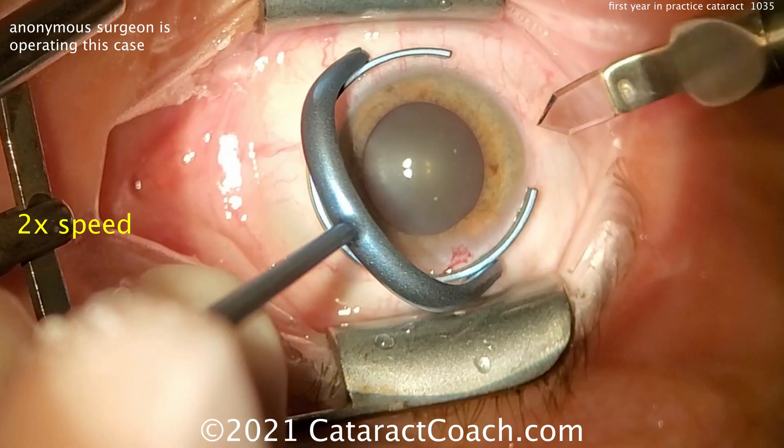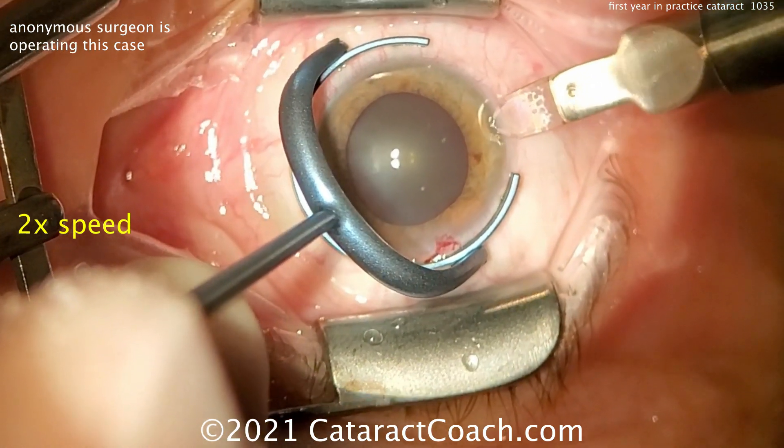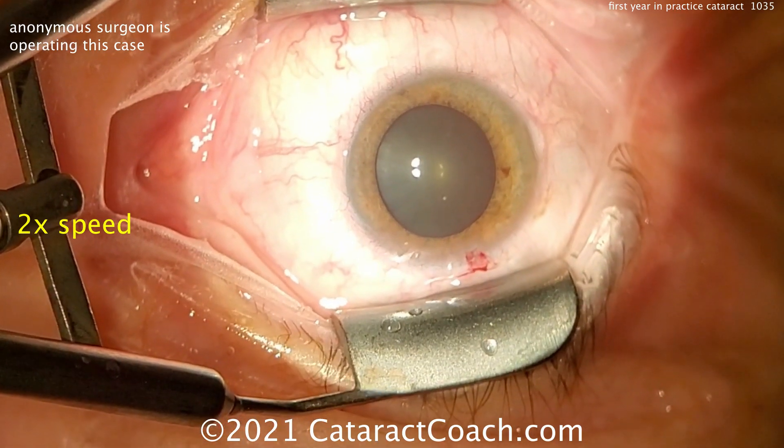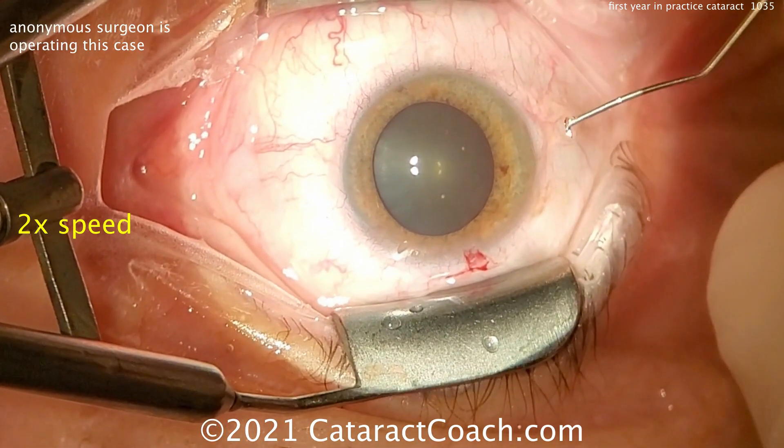Let's see the main incision. A diamond keratome — looks pretty good, pretty reasonable. Good tunnel length, maybe a little on the short side.